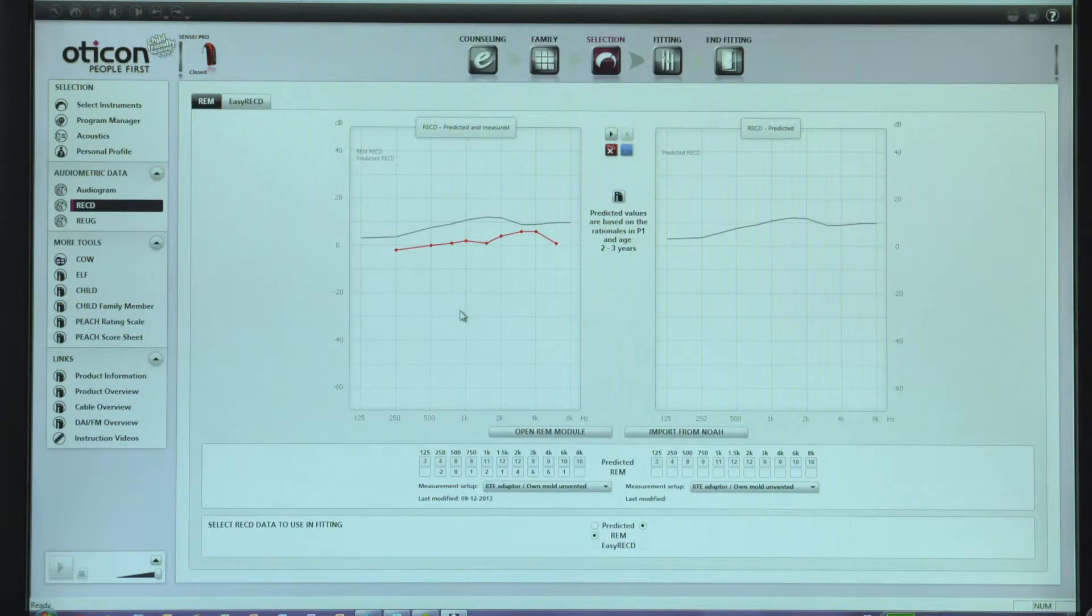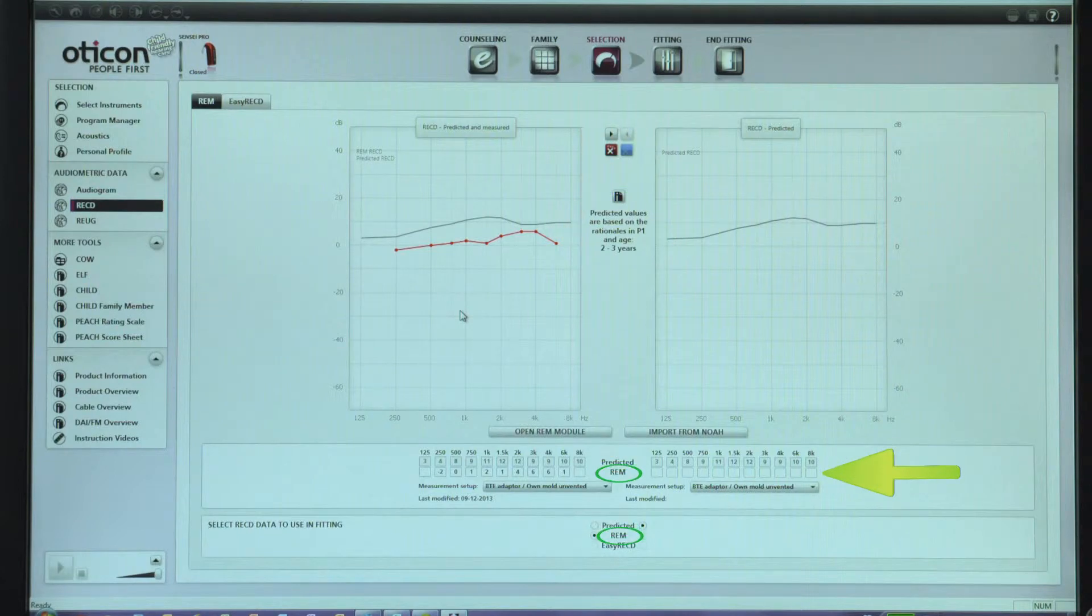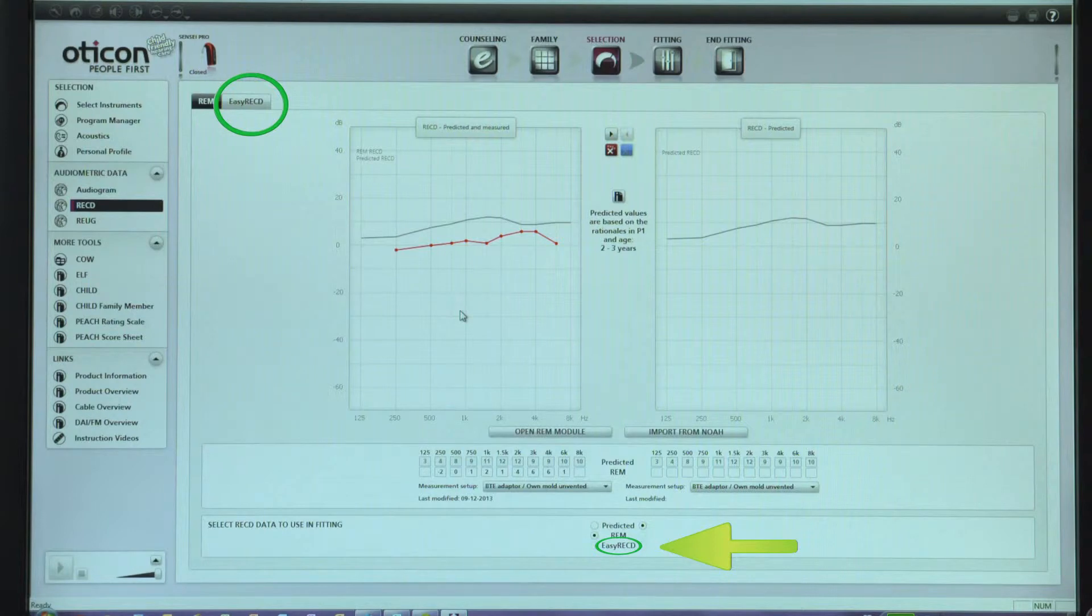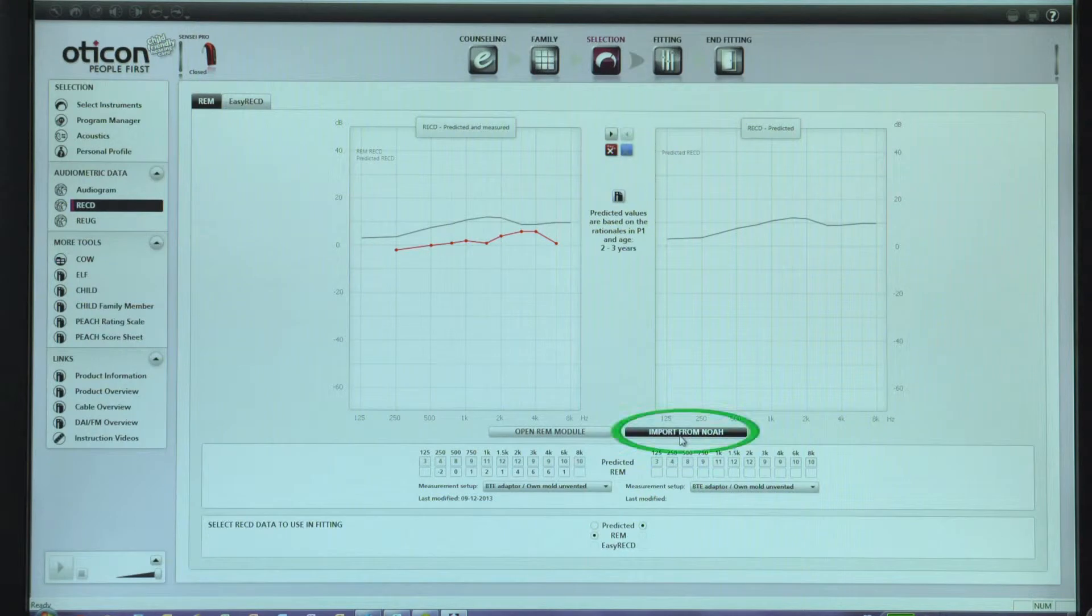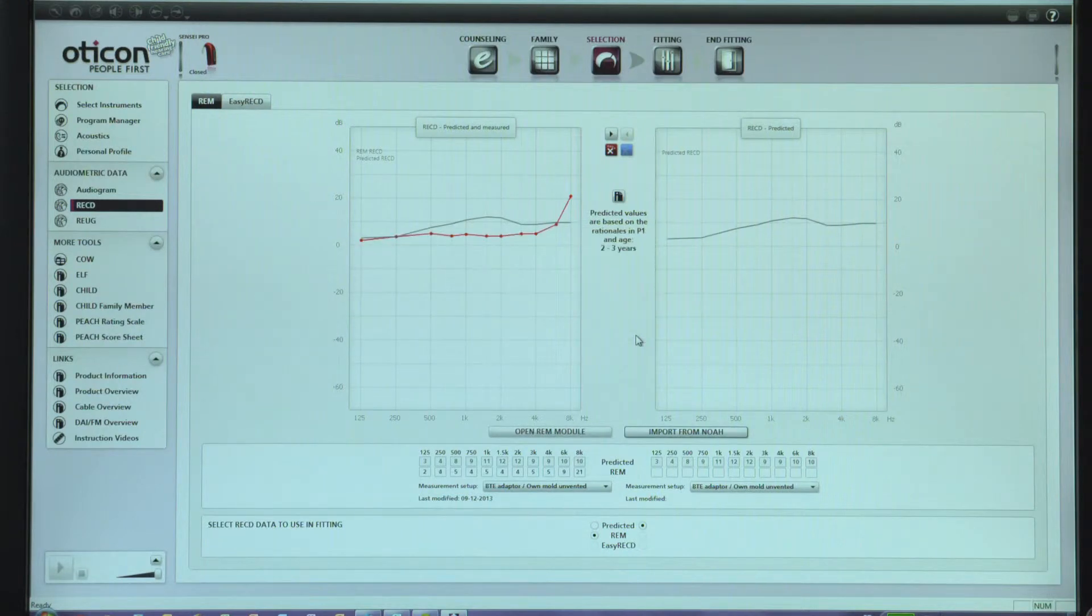Here we can either use an age-appropriate predicted RECD or enter a previously-measured RECD. Alternatively, the easy RECD tool in Sensei Pro is another way of accounting for individual ear acoustics, especially when no measuring equipment is available. This example shows how to use previously-measured RECD data, which was saved in NOAH and then transferred into Genie using the Import from NOAH button. Once the measured RECD values have been transferred into Genie, the software will recalculate the fitting and take these into account.